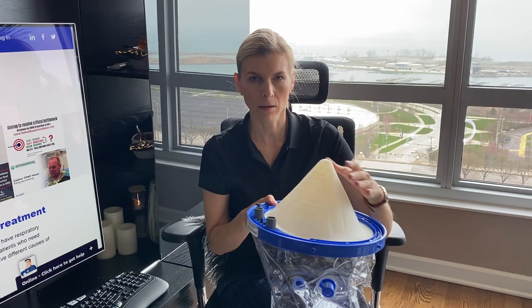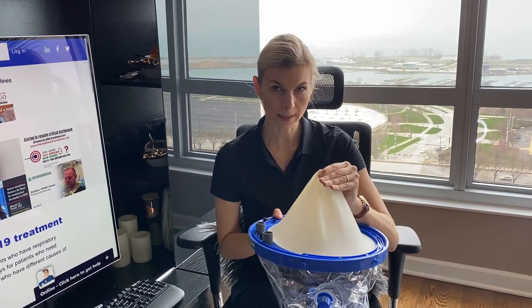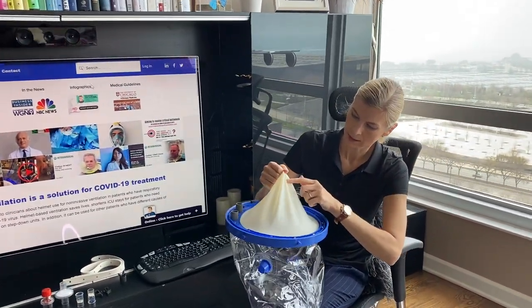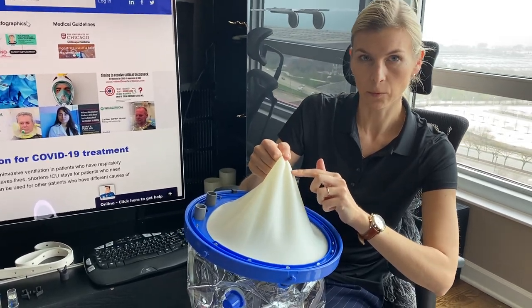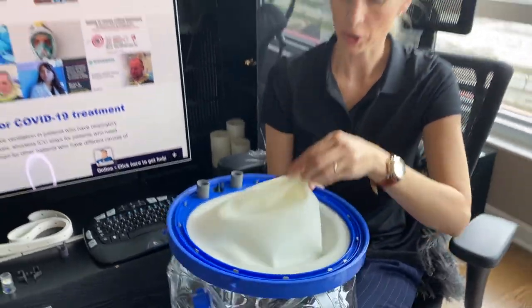Because helmets are in very short supply, I'm not going to cut a hole in this model. But when you measure the patient's neck there is a template — a guideline that shows you the line where you have to cut to make sure that it fits very well around the patient's neck.